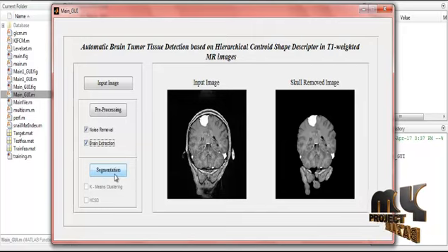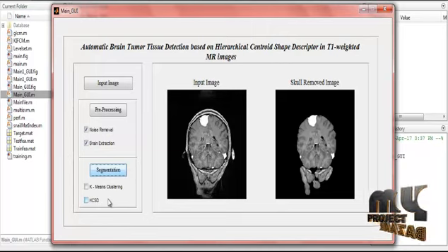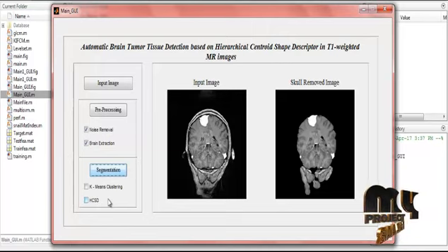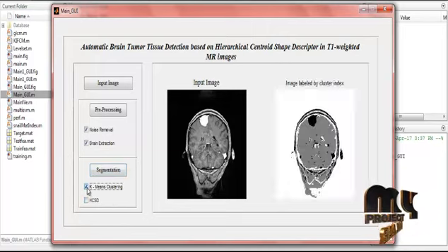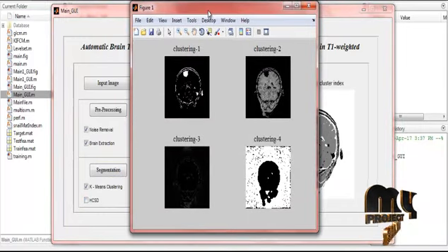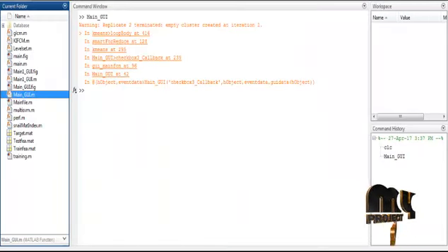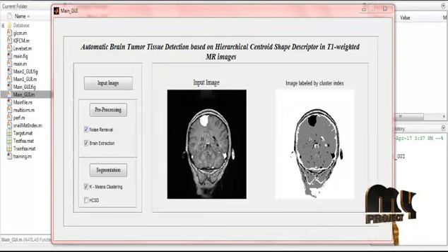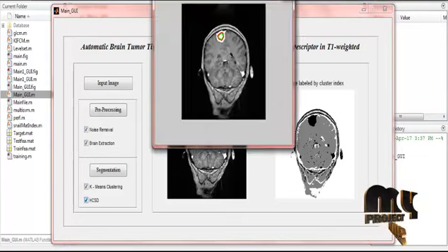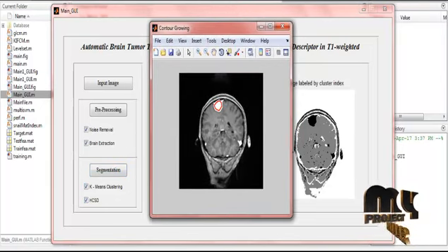The next process is segmentation. Click the segmentation button. There are two types: k-means clustering and HCSD (Hierarchical Centroid Shape Descriptor) for T1-weighted MRI images. Clicking k-means clustering displays four types of clusters — clustering one, two, three, and four — based on the base paper. The image is labeled by cluster index. Clicking HCSD displays the hierarchical centroid-based descriptor with contour growing of the process.